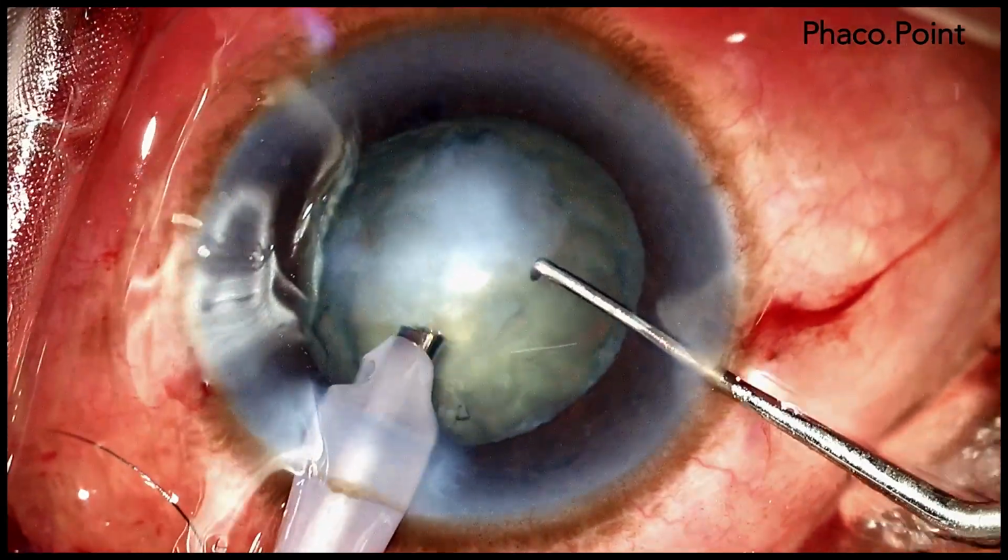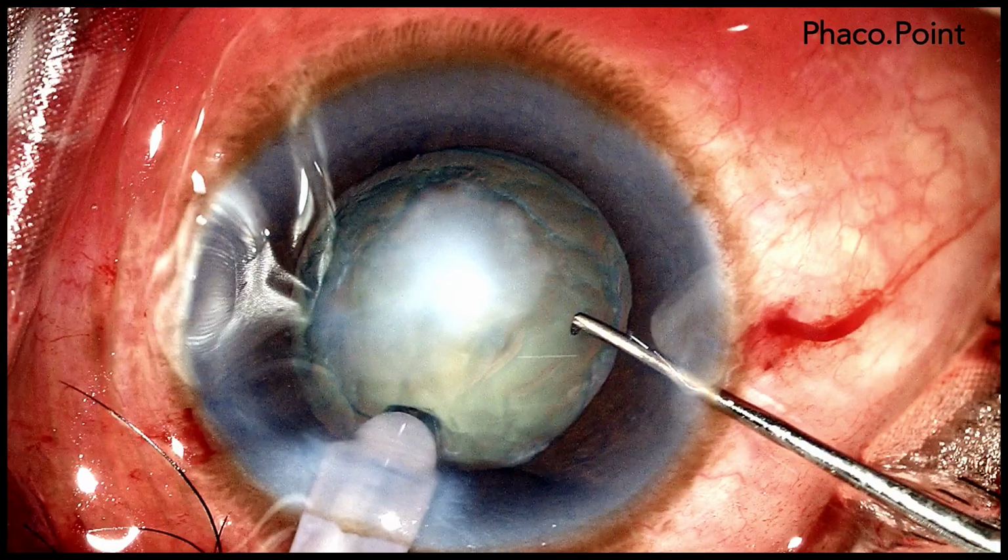With respect to the nucleus disassembly in the patient with the corneal opacity, I would take the following into consideration. Depending on the position and the extent of the corneal opacity, I will try and impale the nucleus and chop it, even slightly eccentrically if required, so as to have maximum visibility.